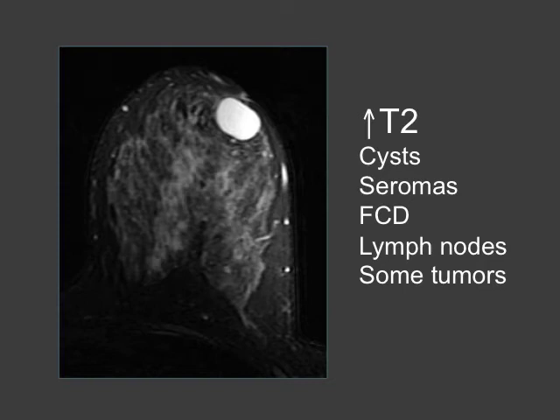Here is a unilateral T2 with fat suppression of the left breast. A cyst appears bright on T2. Seromas are also going to be bright, fibrocystic disease has increased signal, and lymph nodes may be very bright. Some tumors may have higher T2 signal than others, but they are generally not very bright.